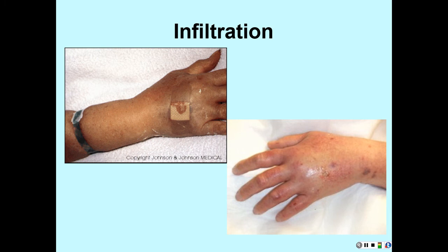They may complain that their skin just feels tight. And you may also notice that you've got IV fluid leaking out of the site. That's a sign right there. Okay.